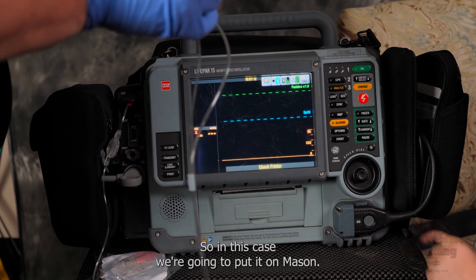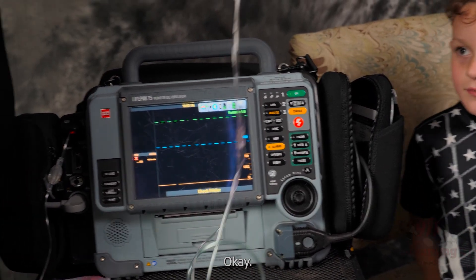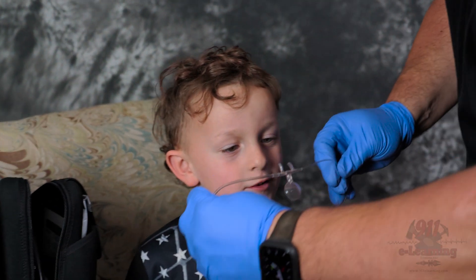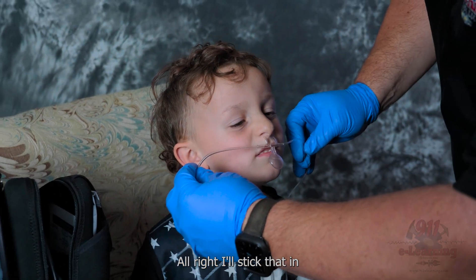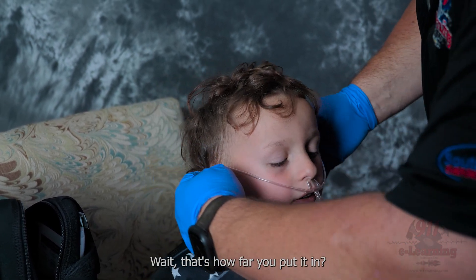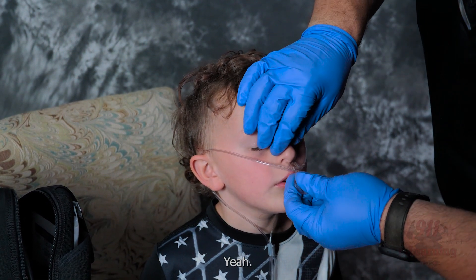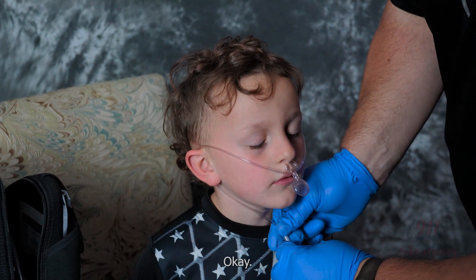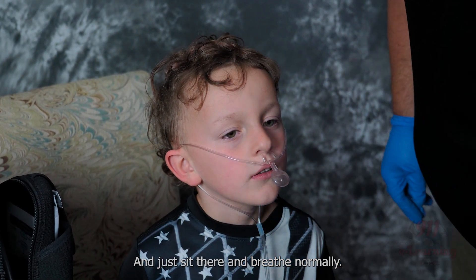We're going to put it on Mason now. Go stick that in, up around — that's how far you put it in? Yeah, that's all we have to do, just right there. And just sit there and breathe normal.